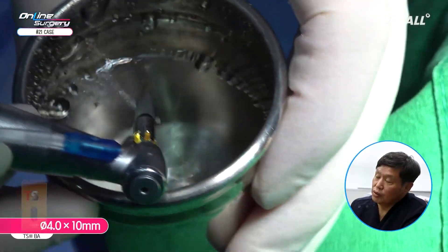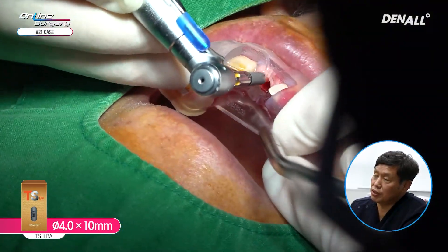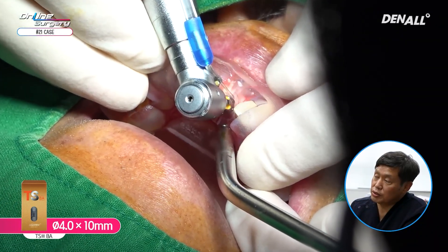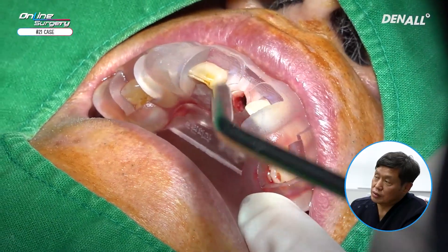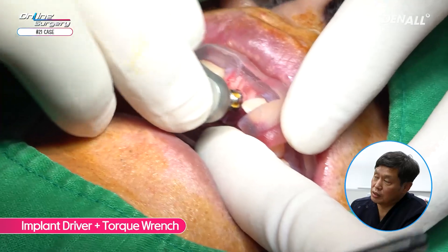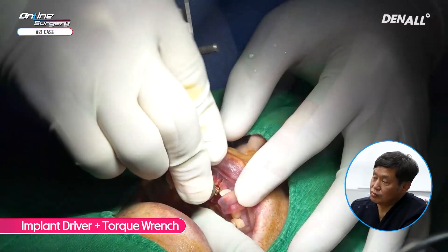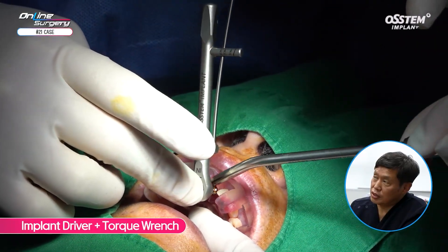Next, we proceed with the 4.0 mm by 10 mm implant. We will use the engine for 70 to 80% of placement, and then use an implant driver to finally position it. With the torque wrench, it is just over 10 N·cm.